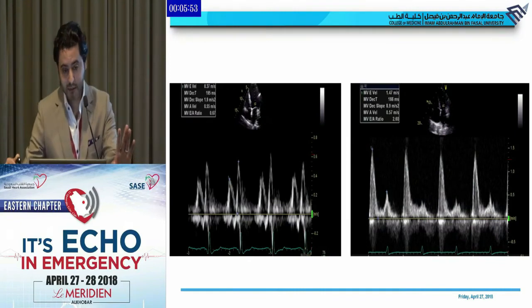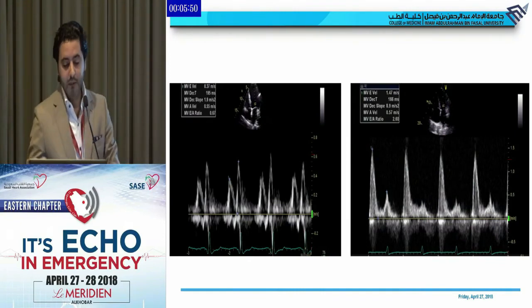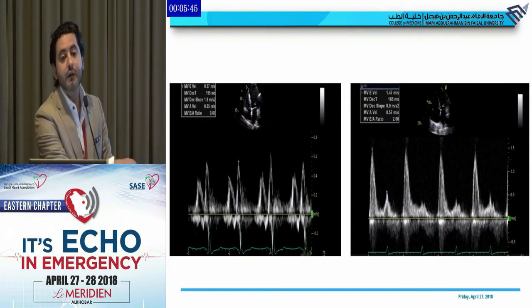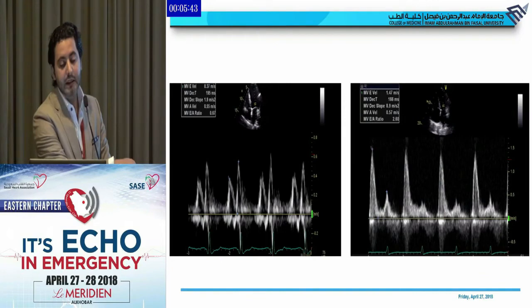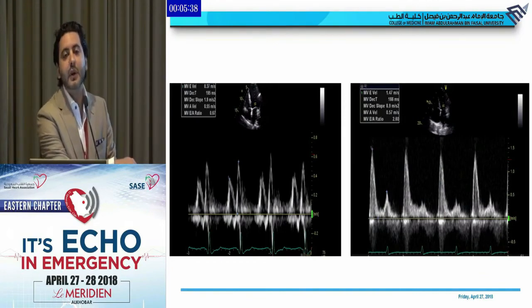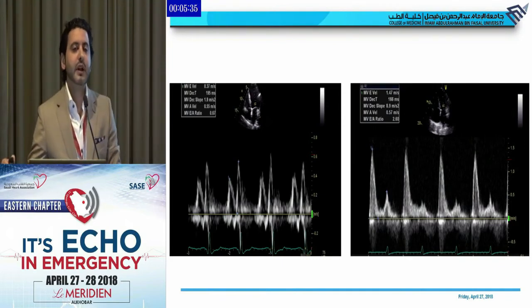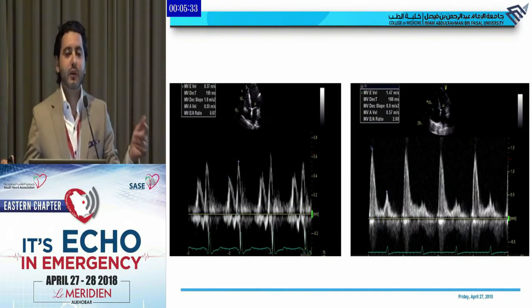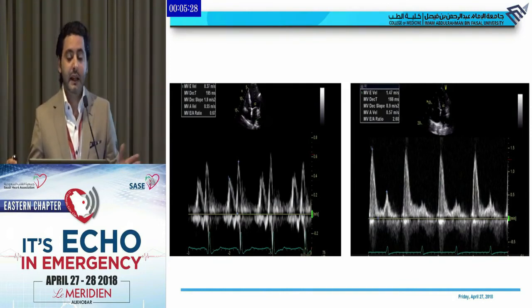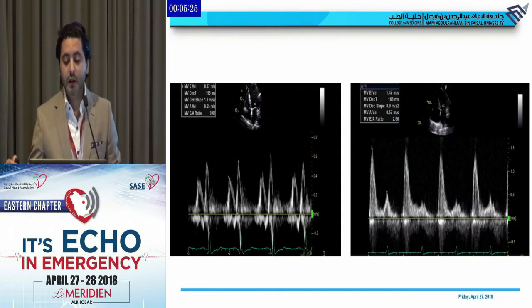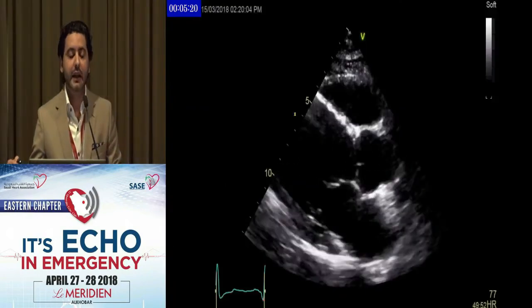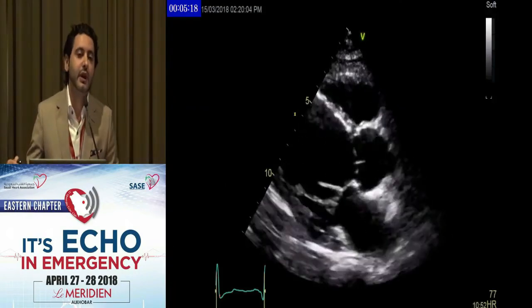Quick example: on the left picture, you have E velocity of 37 and E over A ratio of 0.6. This is straight away grade 1. You don't need LA volume or TR velocity — provided you already know diastolic function is abnormal. On the right, you have an E over A ratio of 2.6 — immediately grade 3. No further parameters needed.